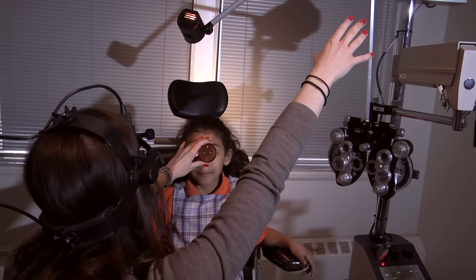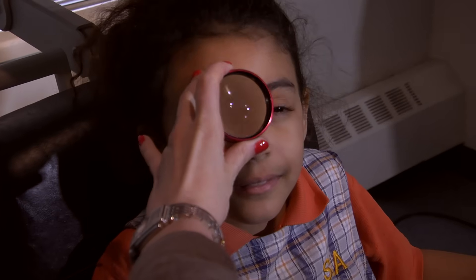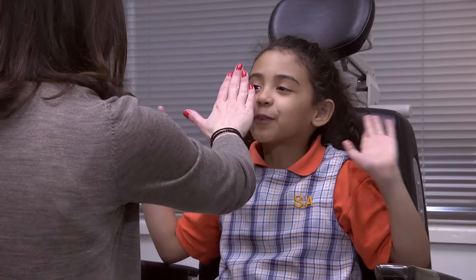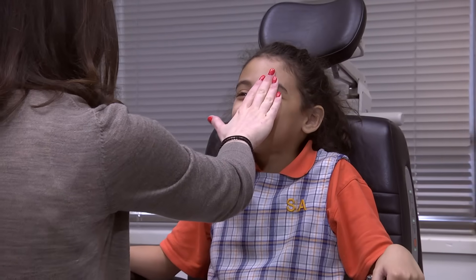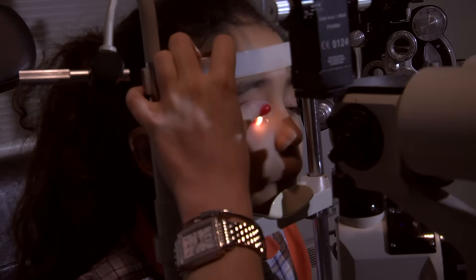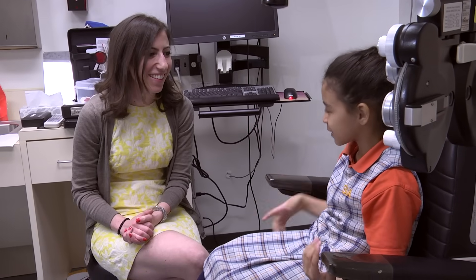There are plenty of diseases that we can find in the back of the eye that you may not have known about, and we can also look at the general health of the child based on these exam findings. Once this test is over, we go over all of the exam results, including whether the child will need a glasses prescription and how healthy the child's eyes are. It's very important that a child gets a comprehensive eye exam, including the dilating drops. Children don't often tell us what they might be noticing or not noticing in regards to their vision, and a complete eye exam can give us these answers.